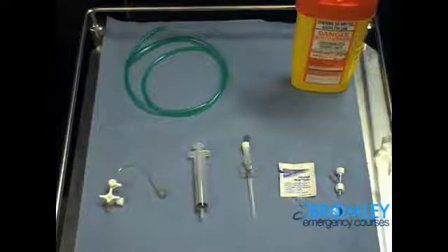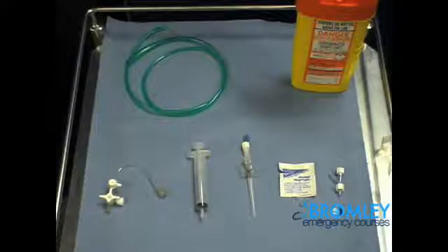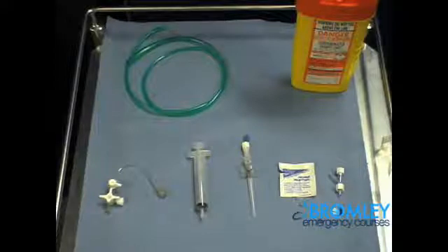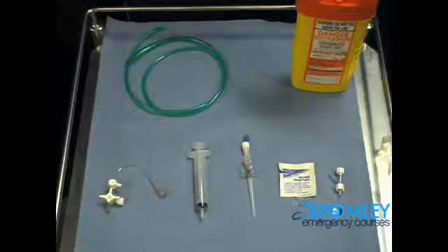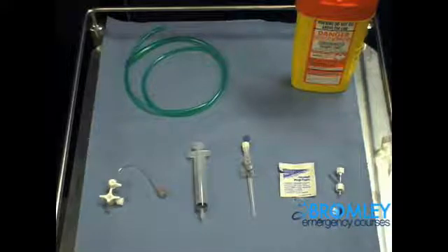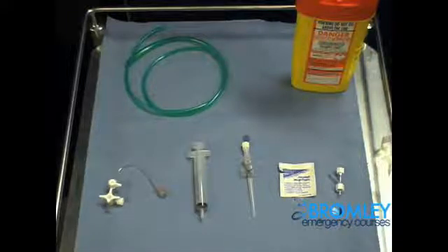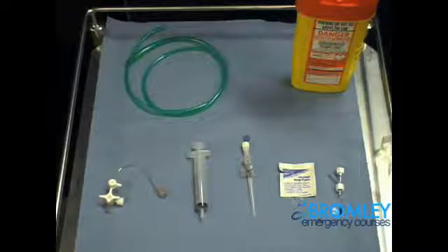This is one of the truly emergency procedures that most of us will never have to perform. However, in the MCEM-OSCE examination, the availability of mannequins means that this procedure can easily be assessed.